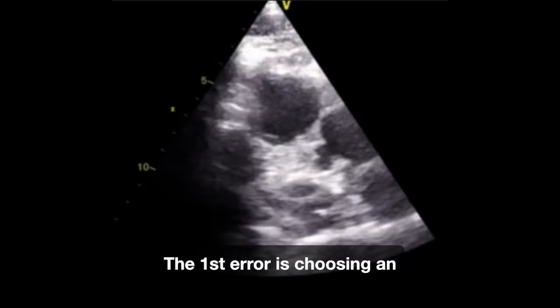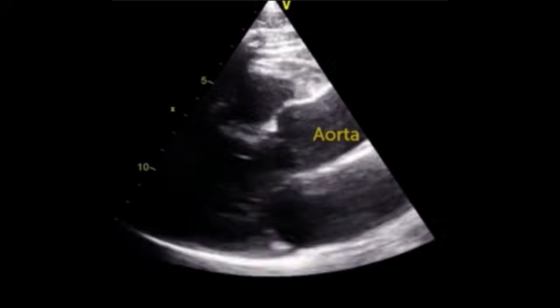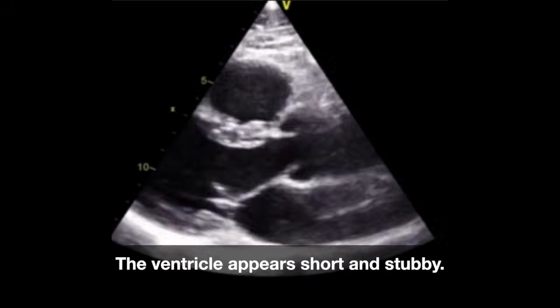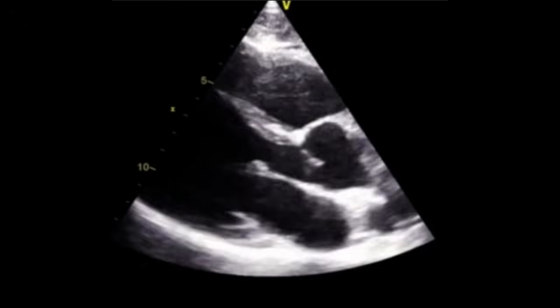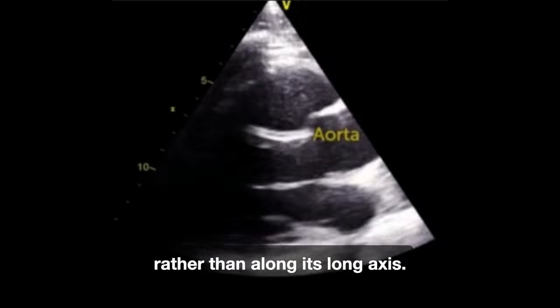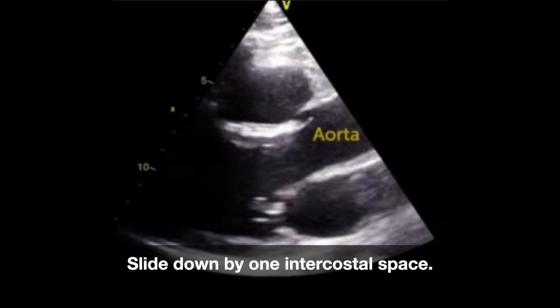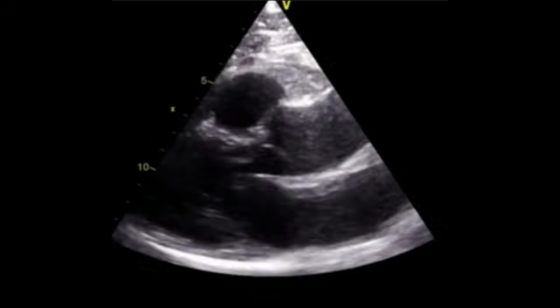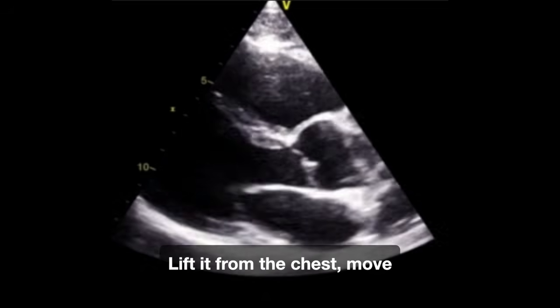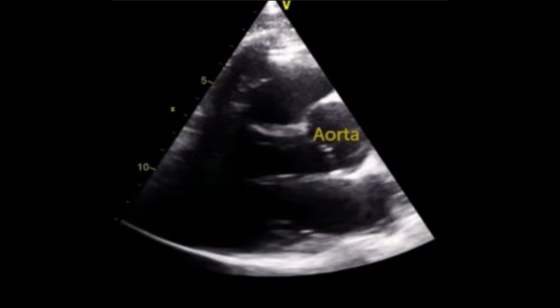The first error is choosing an intercostal space that is too high. The aortic root dominates the screen. The ventricle appears short and stubby because you are cutting through its base rather than along its long axis. The correction is simple. Slide down by 1 intercostal space. Do not tilt the probe downwards. Lift it from the chest, move it, and place it back down.